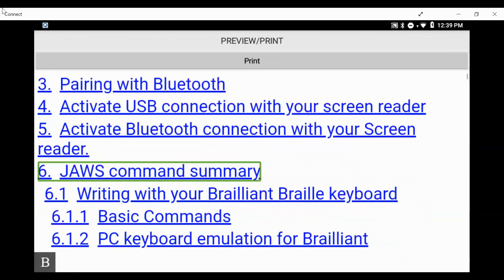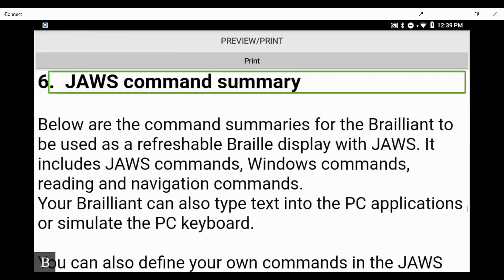I press L again and again until I hear: 'Six, JAWS command summary, link.' That's what I want — to go to the JAWS command summary section. If I press enter here on item six in my table of contents, I'll be taken right to that part of the document. We hear: 'Six, JAWS command summary, heading one' — it is also a heading level one. This reflects how we navigate web pages.